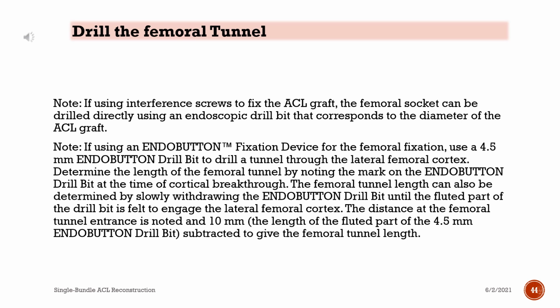Note: if using an endo-button fixation device for the femoral fixation, use a 4.5 mm endo-button drill bit to drill a tunnel through the lateral femoral cortex. Determine the length of the femoral tunnel by noting the mark on the endo-button drill bit at the time of cortical breakthrough. The femoral tunnel length can also be determined by slowly withdrawing the endo-button drill bit until the fluted part of the drill bit is felt to engage the lateral femoral cortex.